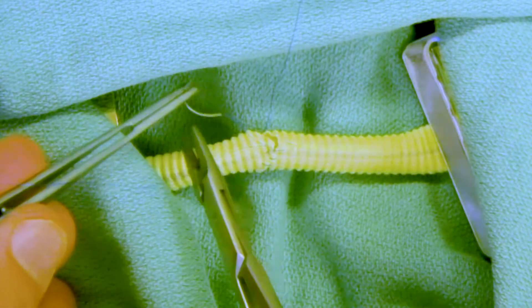Equal bites of equal distance and equal spacing are the goals to have a nice, even suture line.